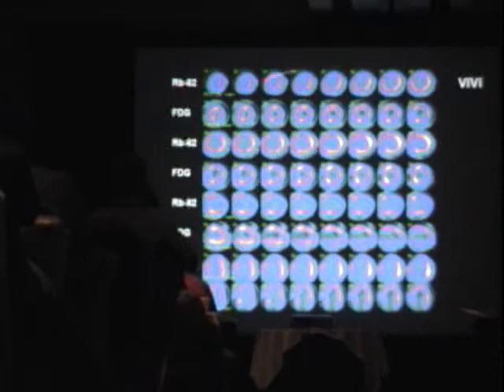The way we address myocardial viability in most centers is using PET imaging, even though SPECT continues to be an option. With PET imaging, the workhorse of viability is FDG, and the pattern you're looking for is the typical classic mismatch, when perfusion is reduced but FDG is preserved. And this mismatch between perfusion and metabolism is the equivalent of this hibernating myocardium that we're looking for, and is highly predictive of improvement in ventricular function following revascularization. So you definitely want to be looking for this. You want to be as quantitative as possible, and there are multiple ways of doing that, but the bottom line, you want to know how big and extensive was that area of particular mismatch.